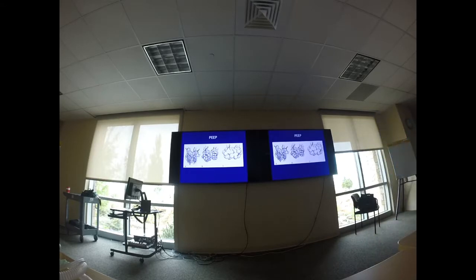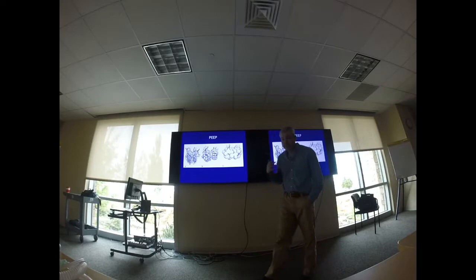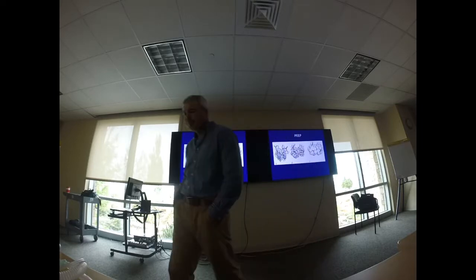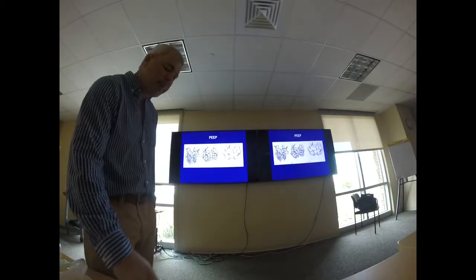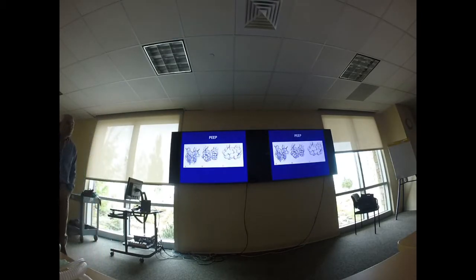This is a picture that demonstrates no PEEP in A, optimal PEEP in B, and then C, too much PEEP. Too much PEEP is going to cause an increase in intrathoracic pressure and a decrease in cardiac output. So it's important to get optimal levels of PEEP.